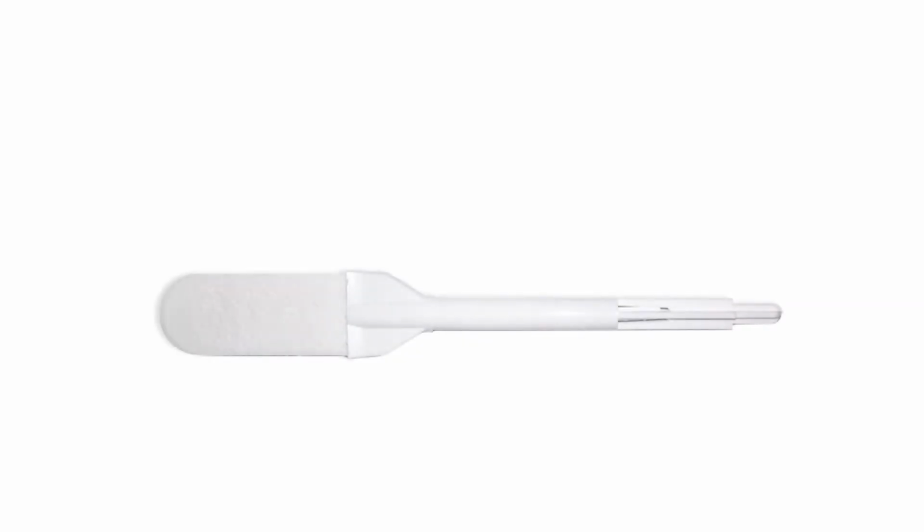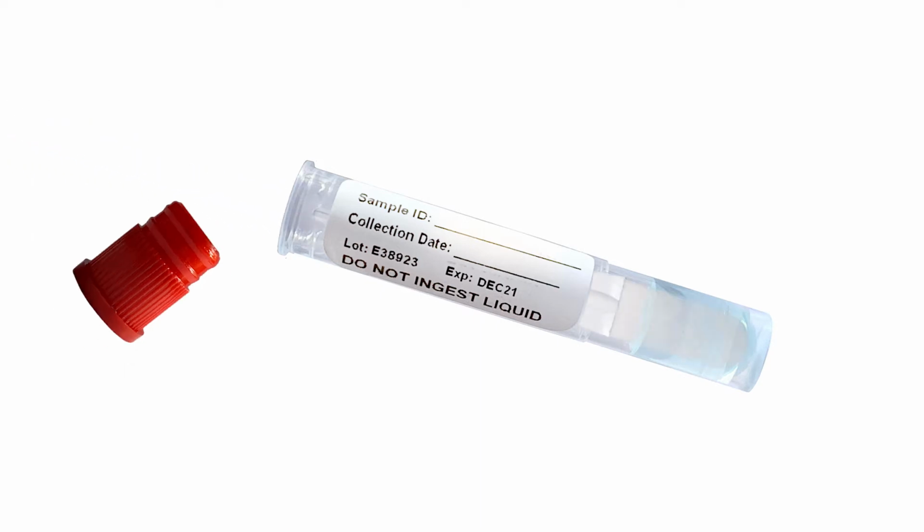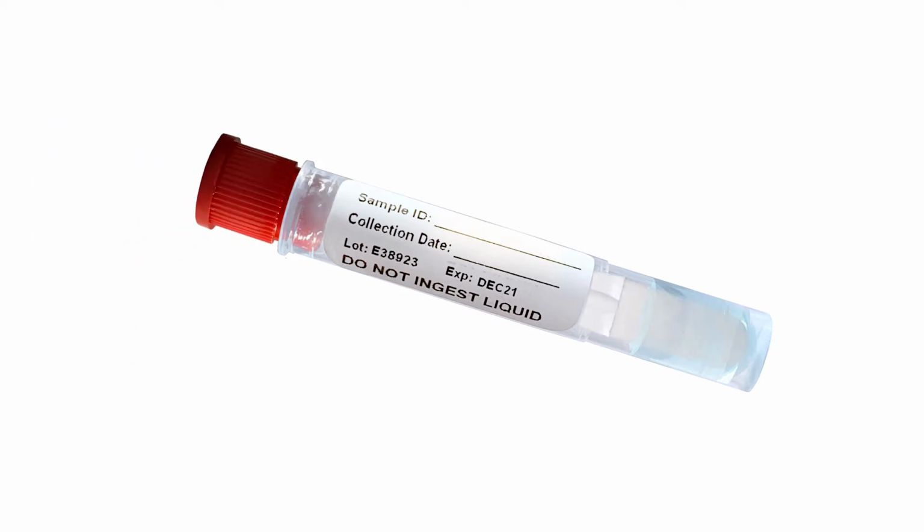Wait until the indicator turns blue, and then remove the collector from the patient's mouth. Using your thumb, uncap the transport tube, insert the collector into the transport tube, and replace the cap. Snap the cap firmly to ensure it is securely closed.